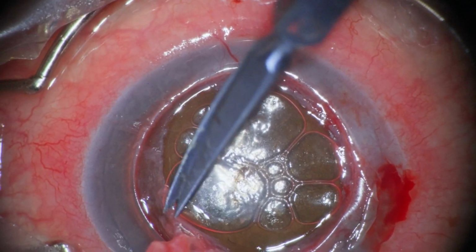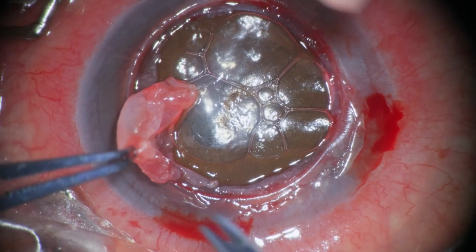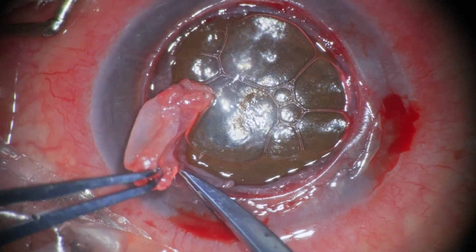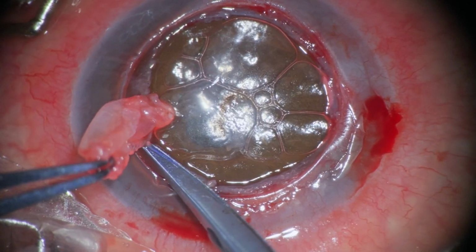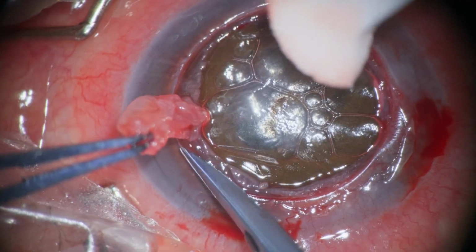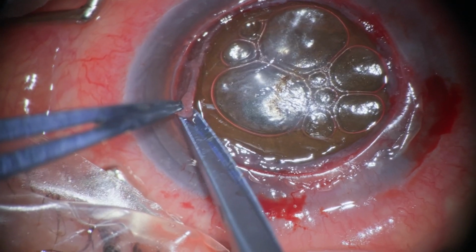You can also appreciate that in the center there is some pigment deposition, and also some haze formation rather than scarring, because Descemet's cannot scar since there are no fibroblasts in it. This is some proof of prior endothelial dysfunction and probably present endothelial dysfunction in the central 3 millimeters. But we appreciate that we've gotten this far, we've managed to bare Descemet's and take out all the scar.